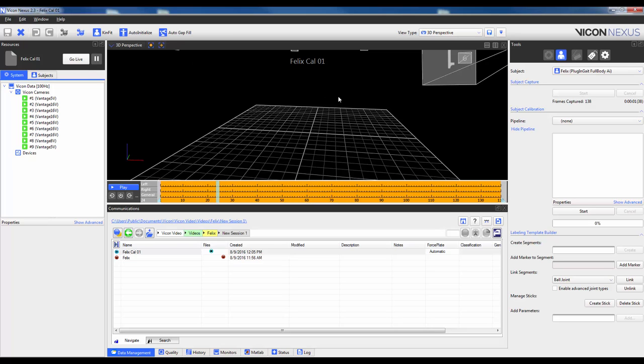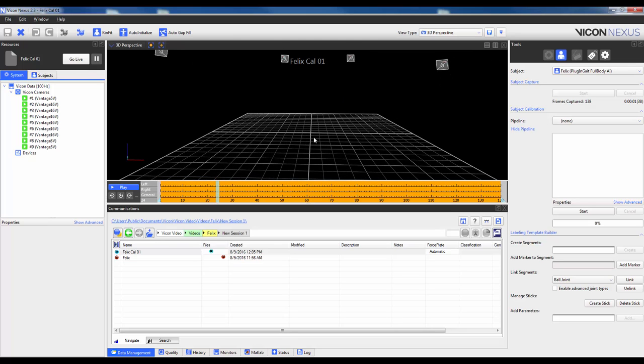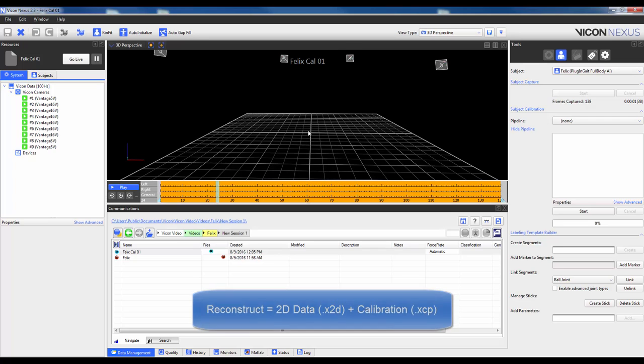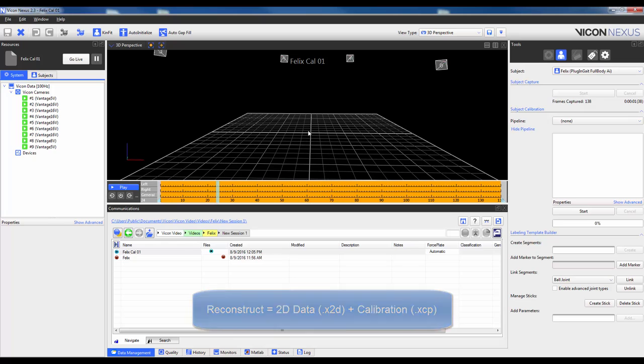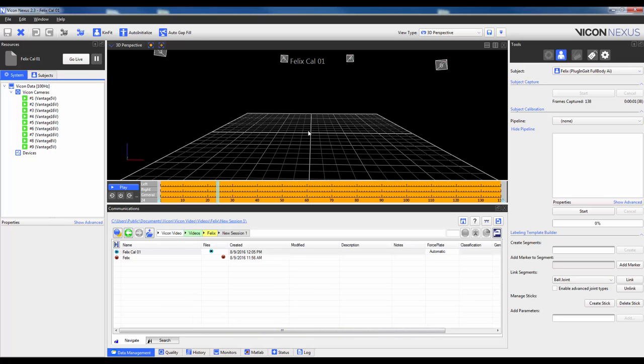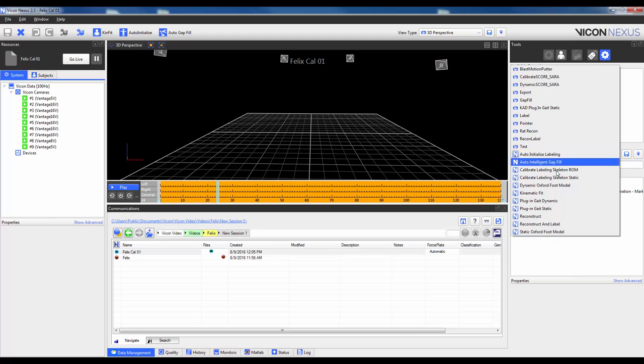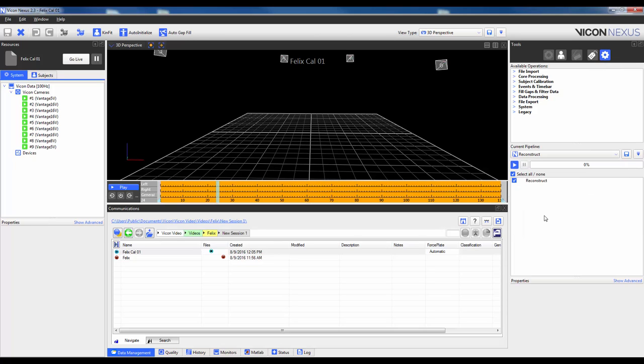So the first thing that they will notice in the workspace view is that there are no markers. By default, Nexus will not reconstruct the markers for you. The term reconstruct refers to the process of combining the data from each 2D camera view with the calibration file to produce 3D marker coordinates. This procedure can either be done from the toolbar, which is really just running the pipeline, or from the pipelines list, which is over here. So I will do this from the toolbar.